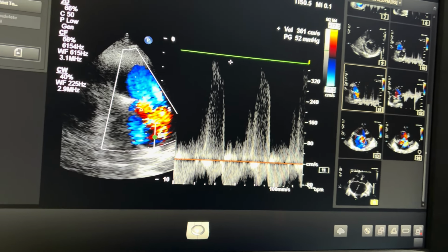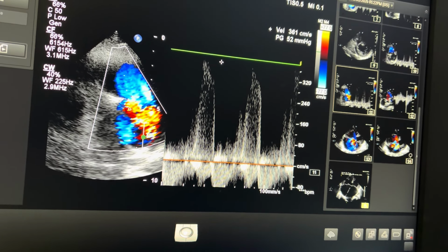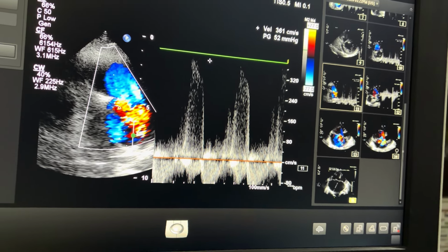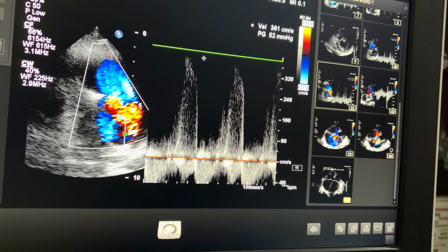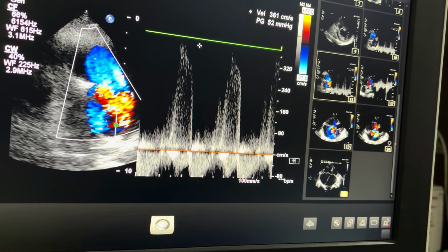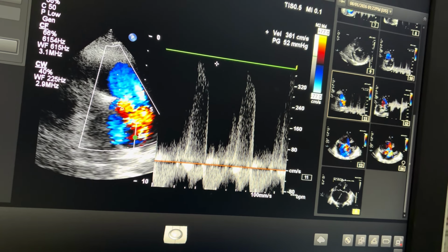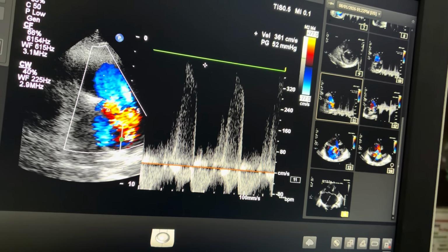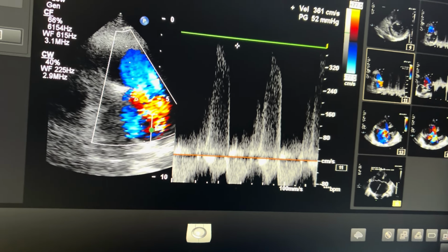That is the formula. So you have to add 52 and 20 in this scenario. You can add even 10, you can add even 5. It depends on the size of IVC, right atrium, right ventricle. So you know the IVC is dilated and not collapsing more than 50% with sniff test. That indicates pressure is very high. That is approximately 10 to 20. Average you can take 15 millimeter mercury.